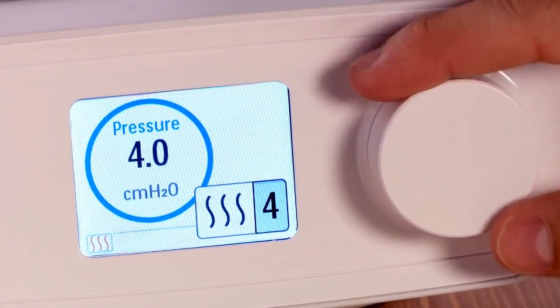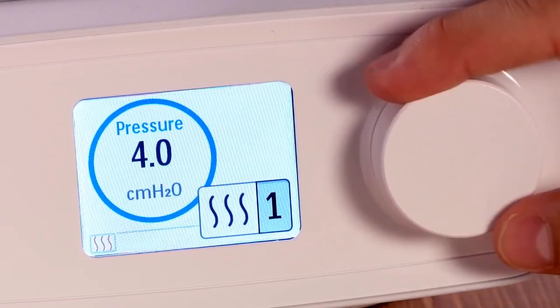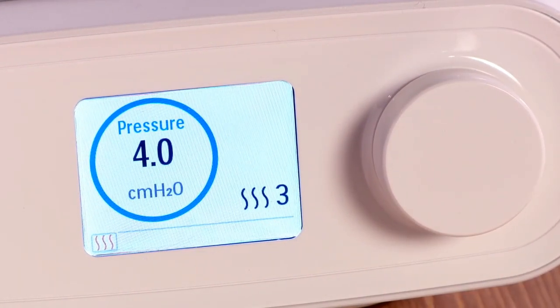If you are using the standard tube, rotate the dial to choose a setting from 1 to 5, with 5 offering the greatest amount of moisture. Press the dial to save the change. If you would like to turn off the humidifier heater plate, adjust your setting to 0.